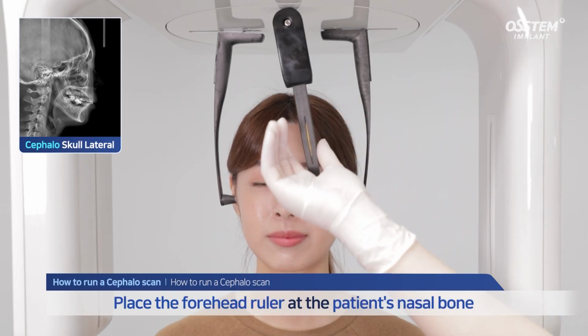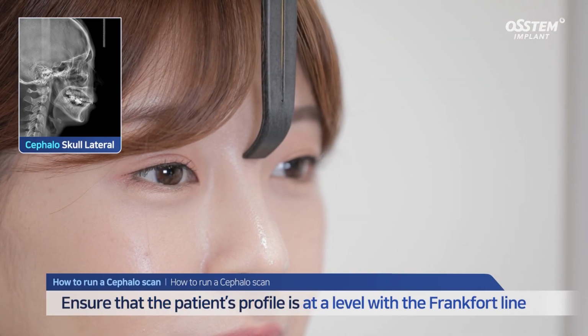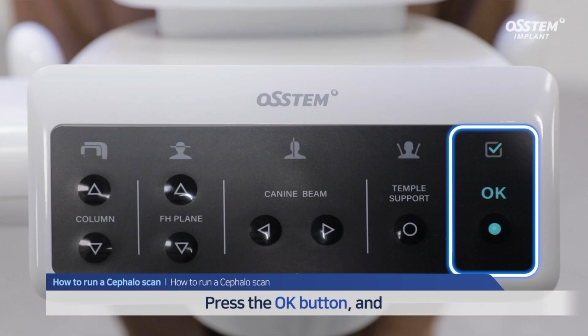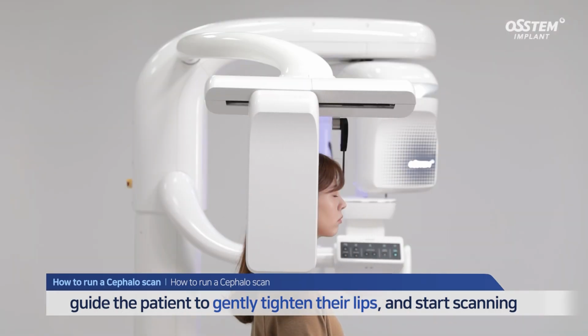Place the forehead ruler at the patient's nasal bone. Ensure that the patient's profile is at a level with the Frankfort line. You can control it by raising or lowering the head. Press the OK button, instruct the patient to gently tighten their lips, and start scanning.